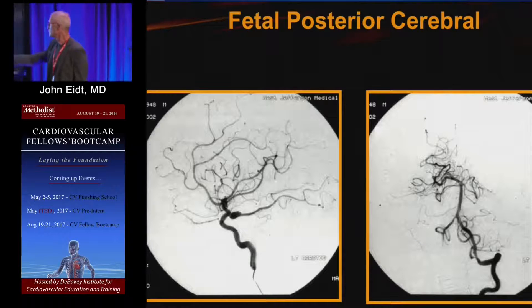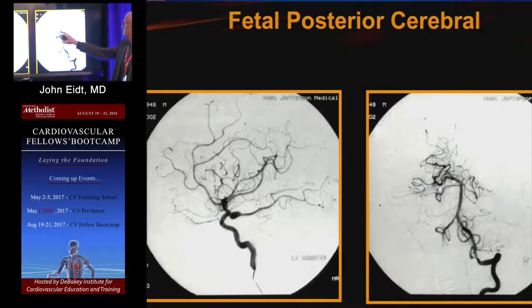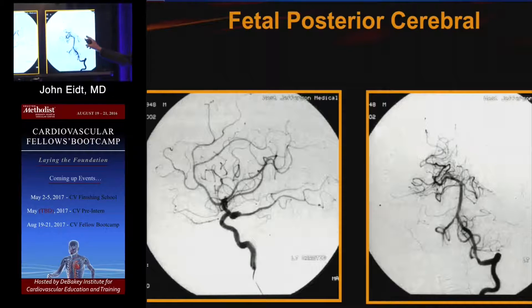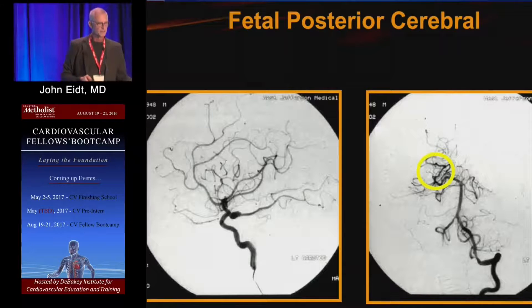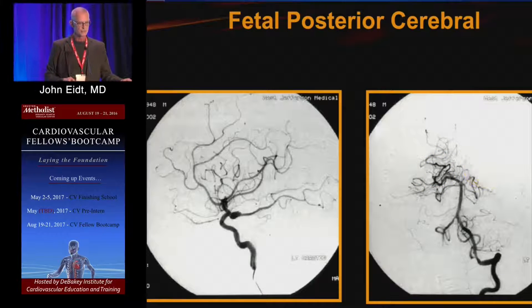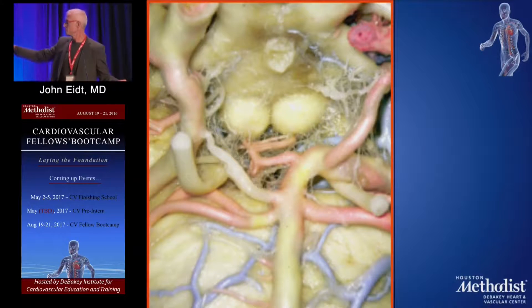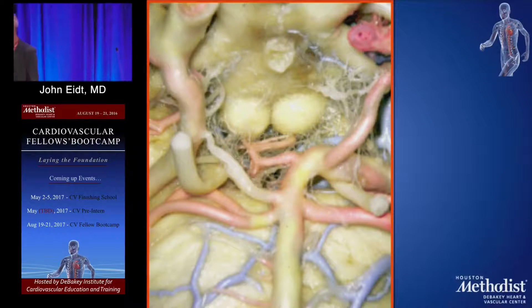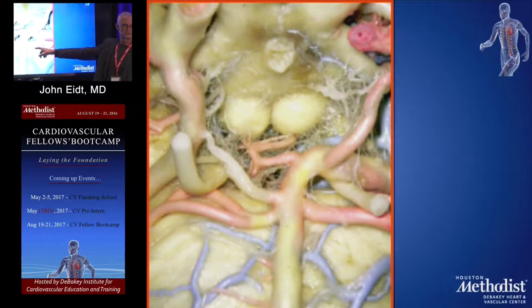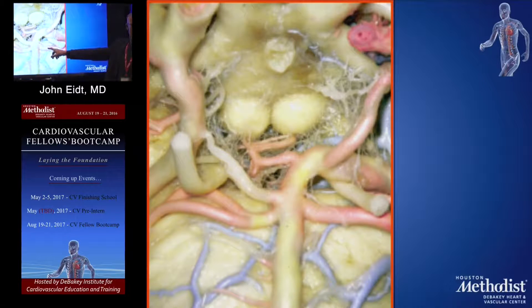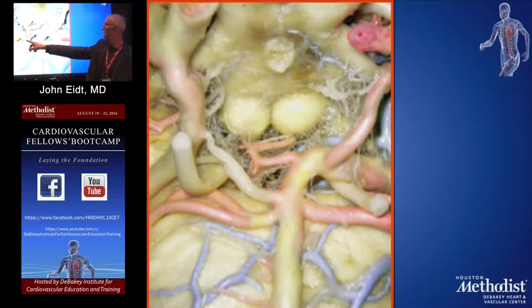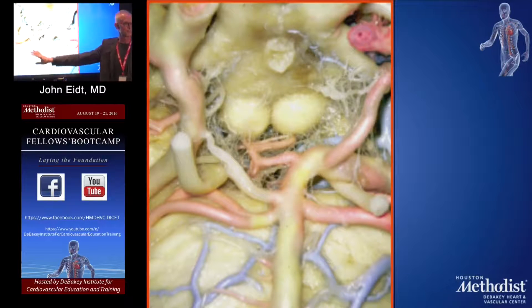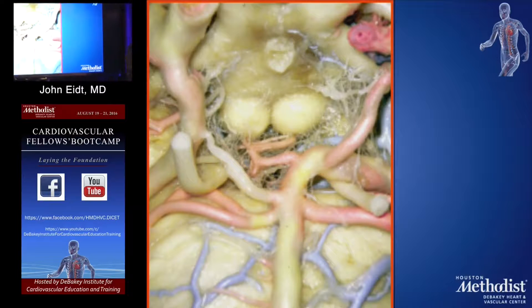This is the AP view of the same thing. Here's the basilar artery — you can see the whole posterior circulation on the right side, but you don't see the left PCA because it's filling off the PCOM. You can see the posterior cerebral through the posterior injection; on that side you don't see it. On this side P1 is atretic, with a big PCOM going into the posterior cerebral — this is the posterior fetal circulation in an anatomic model. This is a picture you ought to have in your head: basilar artery, superior cerebellar, P1.